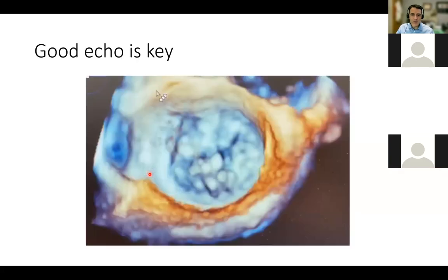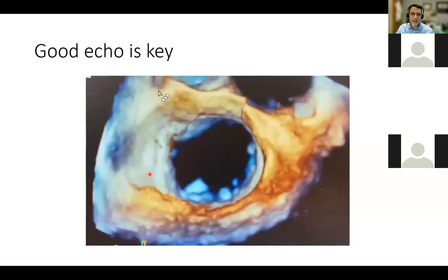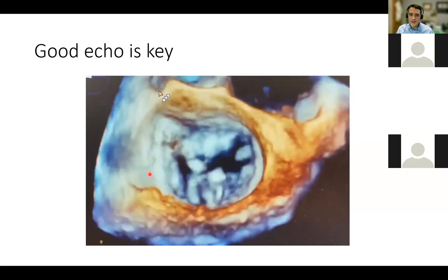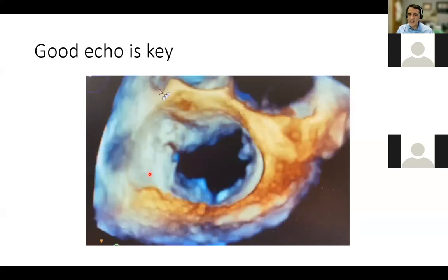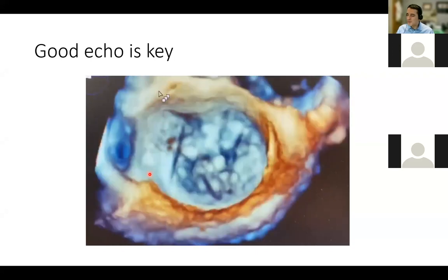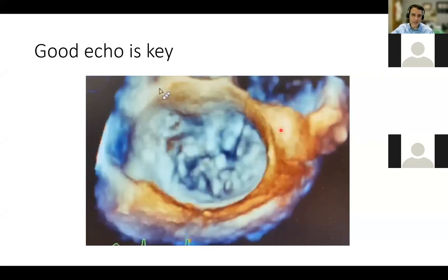And this is what we did. Again, I wanted to show one more echo. This is a view of the 3D echo. And for those of you who do 3D echo in this type of patient, this is particularly helpful to us, particularly when we consider MitraClip.